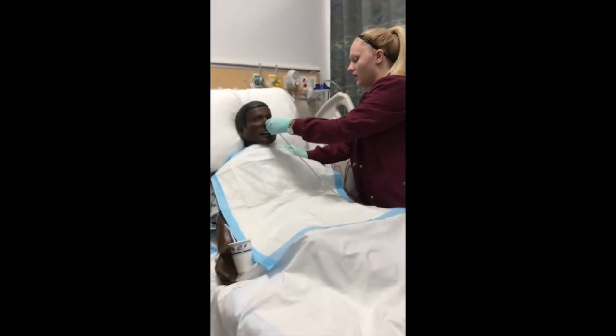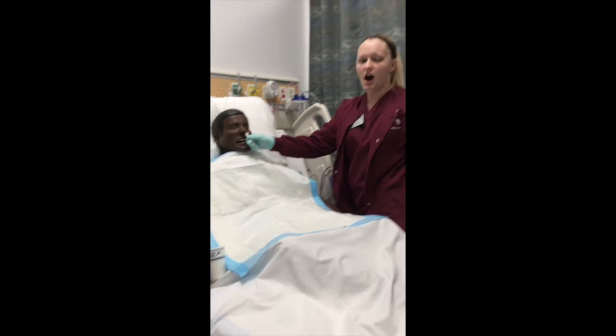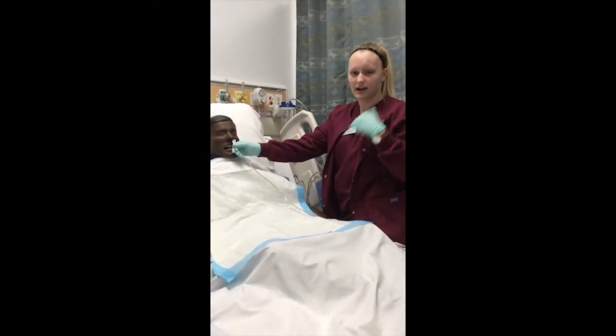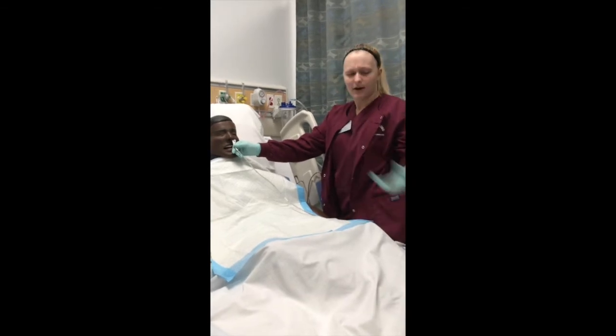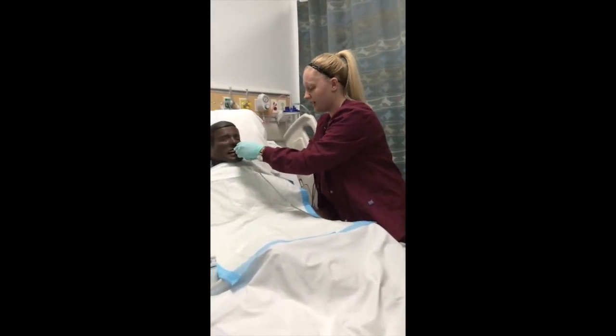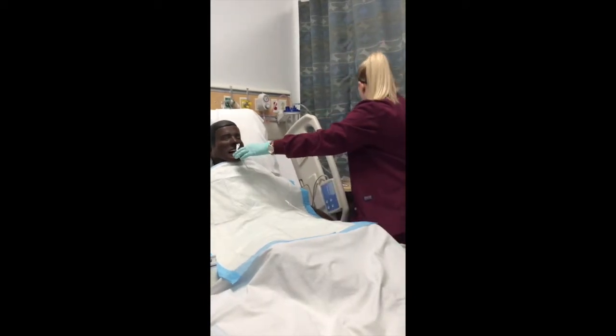So if they were to cough or gag, I would stop inserting lightly until they stopped coughing, and then I'd have them swallow and everything. So I'd also have that basin ready if they were puking. Okay, so I've reached the tape. I'm going to go ahead and tape it on good.